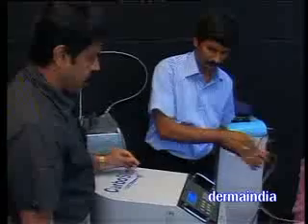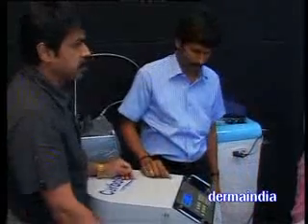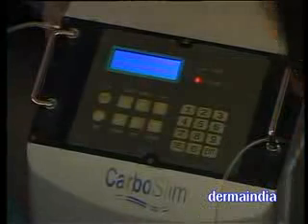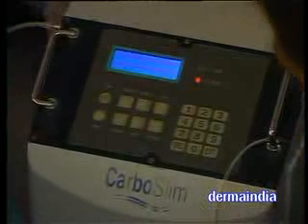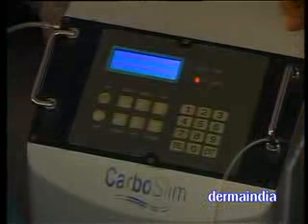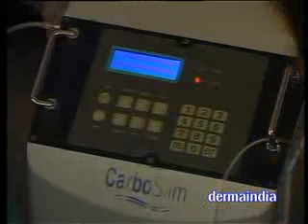Next procedure is carboxytherapy, otherwise known as a carbo-slim apparatus. We can use this carboxytherapy for 5 conditions. 1, obesity and cellulite, to reduce the fat. 2, gynecomastia. 3, it can be used in anti-aging procedures also. 4th one, striae. 5th one, periocular melanosis.